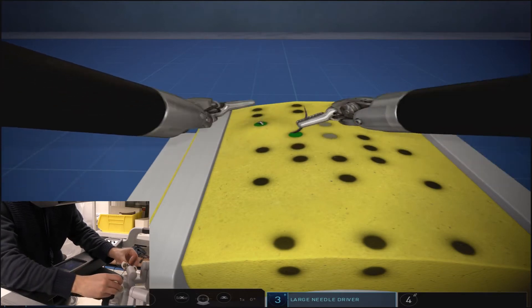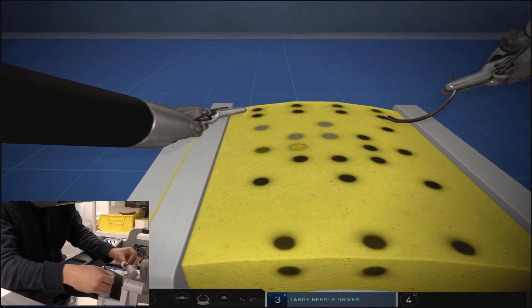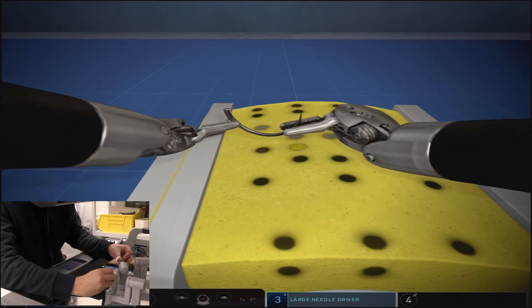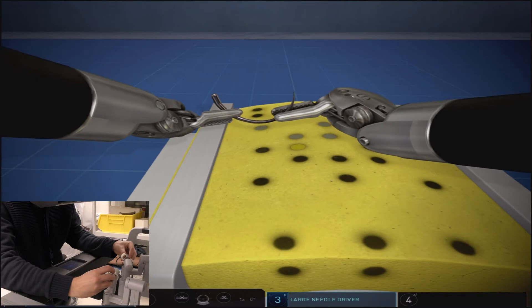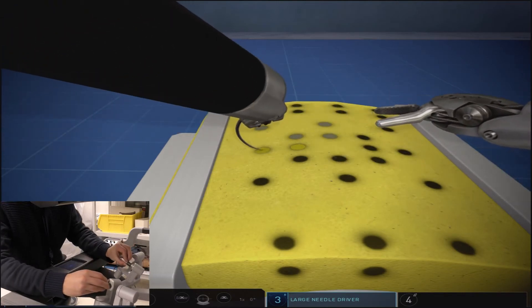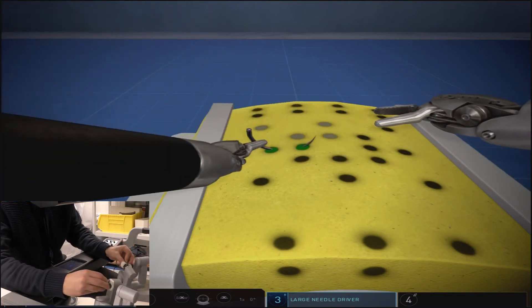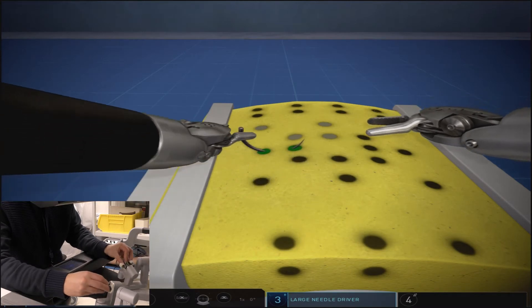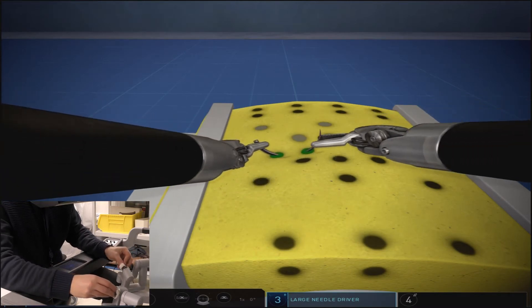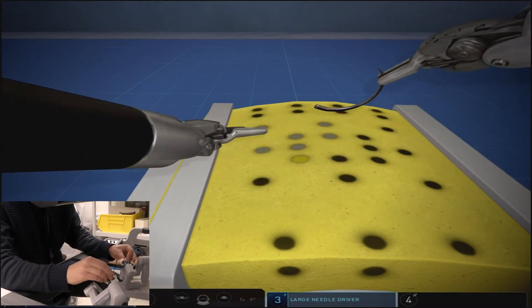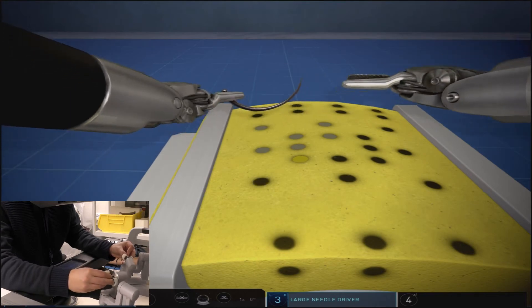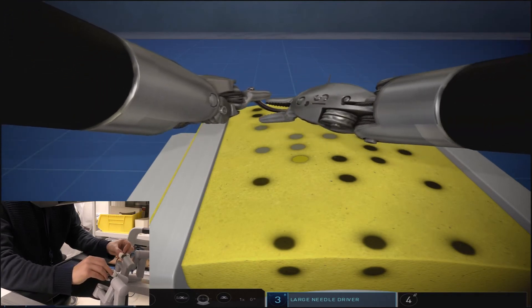I found that this tissue is a little more forgiving in terms of excessive force and tissue penalties on the pull through compared to some of the other suture exercises, but it's still very important to make sure you follow the curve of the needle on your pull through without any excessive force in order to avoid those penalties.